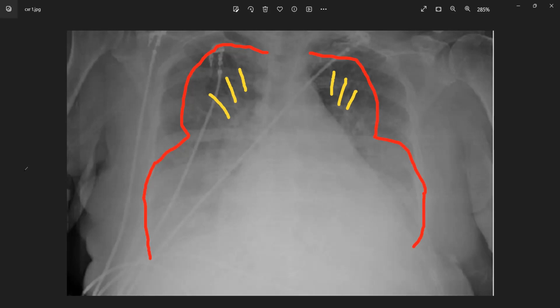As I had said, we've also got a cardiomegaly that's going on over here. So I would guess that we're looking at just from about there to about there, that we've got our cardiac shadow, but it could be larger, it could be smaller. Sometimes if it's not as dense, and to be dead honest, this X-ray is a little bit underpenetrated. If it was a bit better penetrated, we could well probably see a right ventricular enlargement.